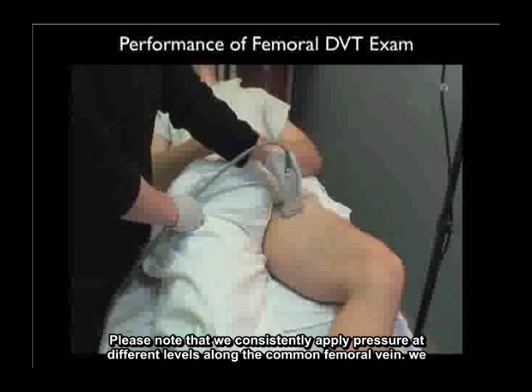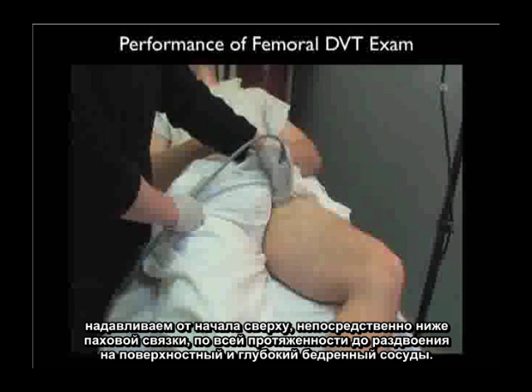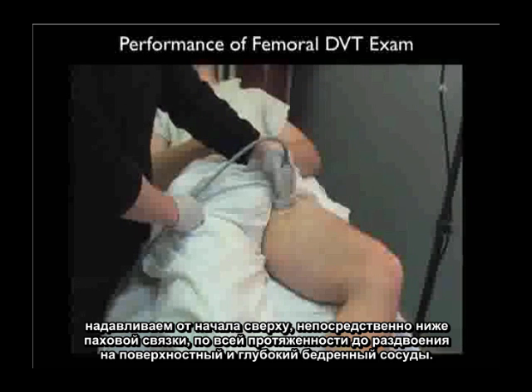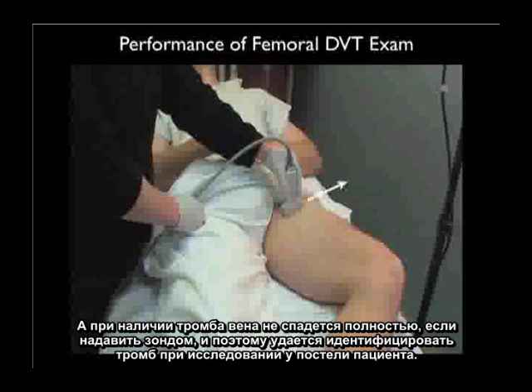Notice that we're sequentially compressing at different levels along the common femoral vein, compressing from the beginning at the top just below the inguinal ligament, all the way down through bifurcation into the superficial and deep femoral vessels. Now a clot will not completely compress with pressure down with the probe and thus will be identified on bedside examination.